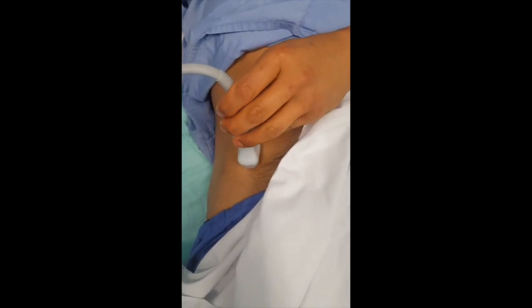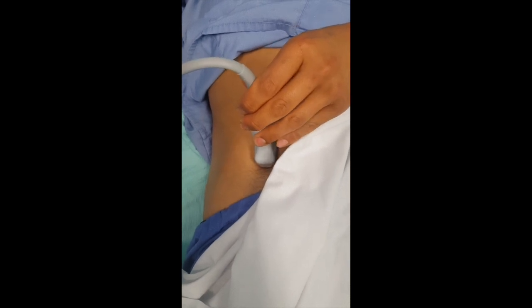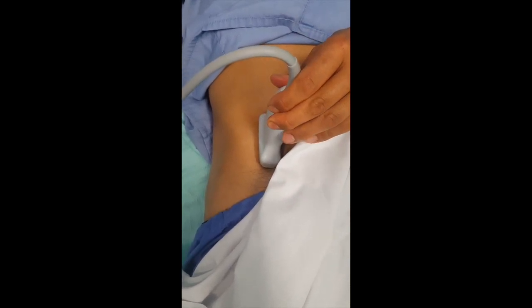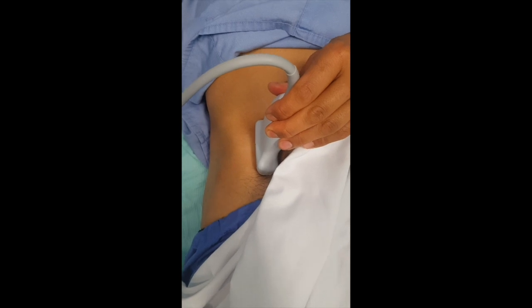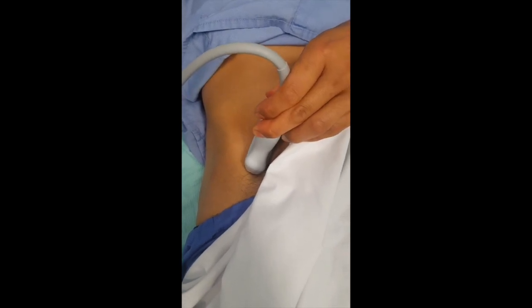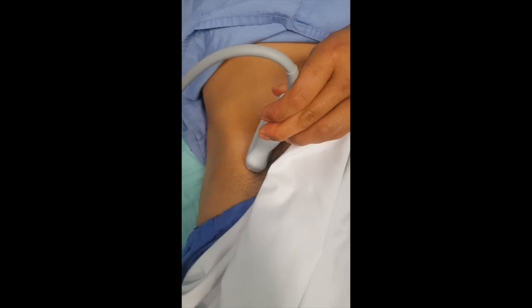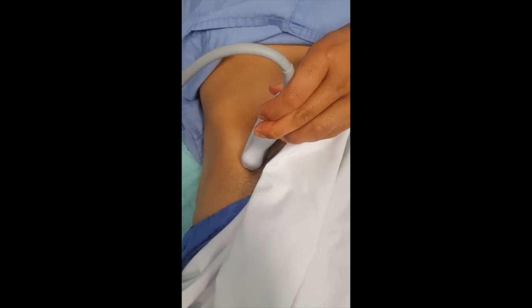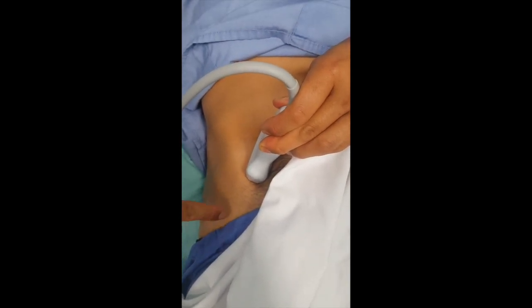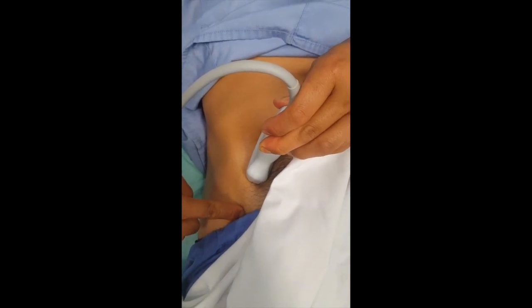Start to move the probe medially and tilt it so that the head of the probe is scanning the lateral aspect of the pelvis. You may need to rotate the probe in order to optimize your image. When performing the block, the needle will be pointing in a cephalic direction and will be entering about two centimeters inferior to the end of the probe.